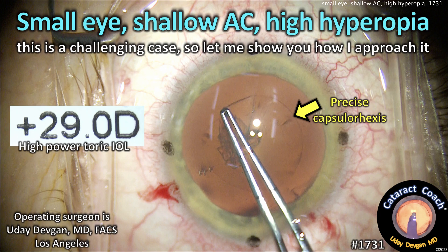CataractCoach.com. Small eye, shallow anterior chamber, high degree of hyperopia — a tough case. Let me show you how I approach it.